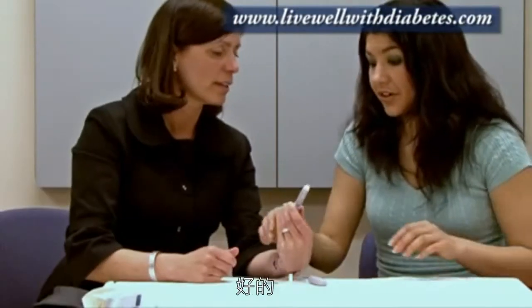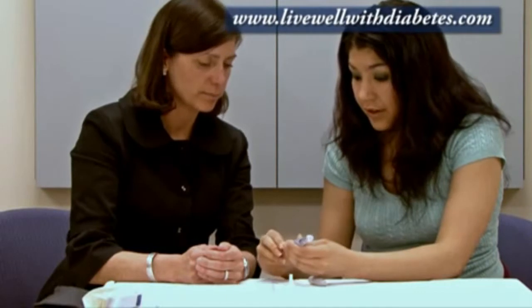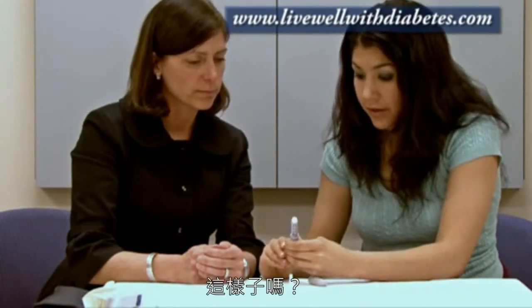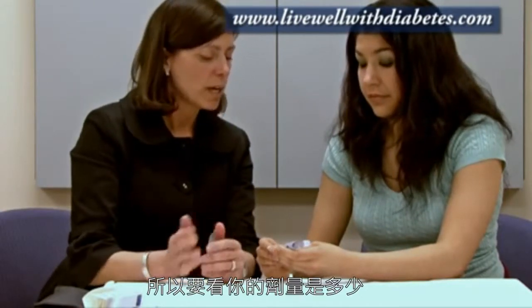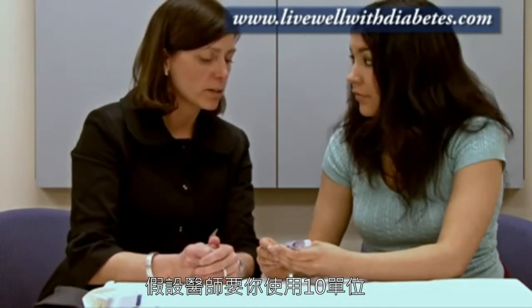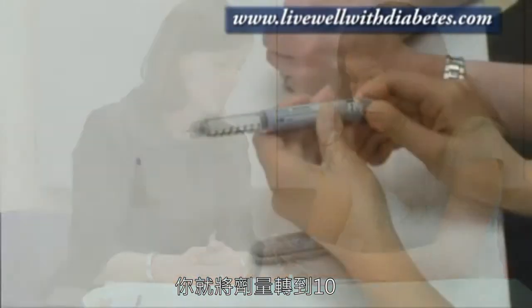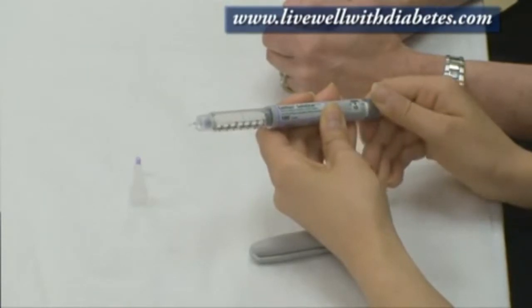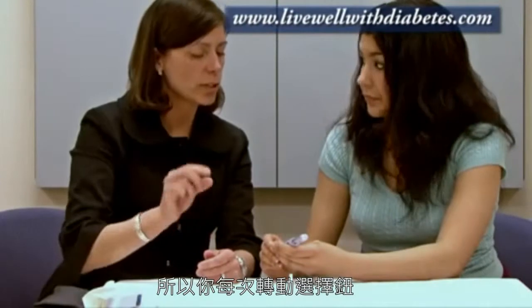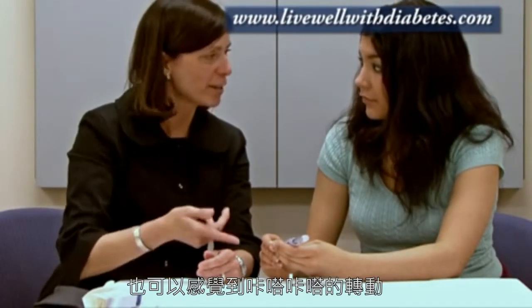Did you want to try that? Sure. So it's at zero — just turn it to one right there. There we go. Perfect. So depending on your dose of insulin, let's say the doctor suggests ten units, you would just turn that to ten. Every time you turn the dial it changes by one unit — you can hear the clicks and you can feel the clicks.